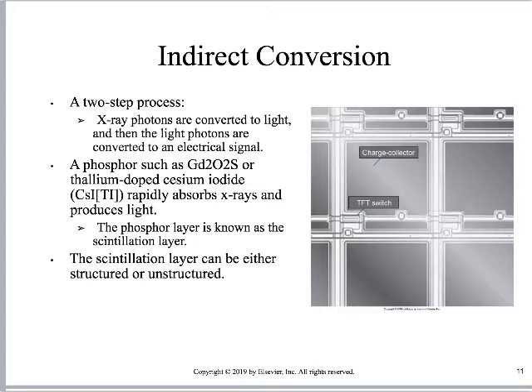What's its positive? It's turbid, right? It's not going to get broken. Like, you can stir the mud puddle up and what happens? The mud settles back down. You're not going to break it, right? So these are more resilient machines, like archaeologists that go to X-ray mummies and they're dropping detectors and stuff like that. They want a gadolinium oxysulfide detector.